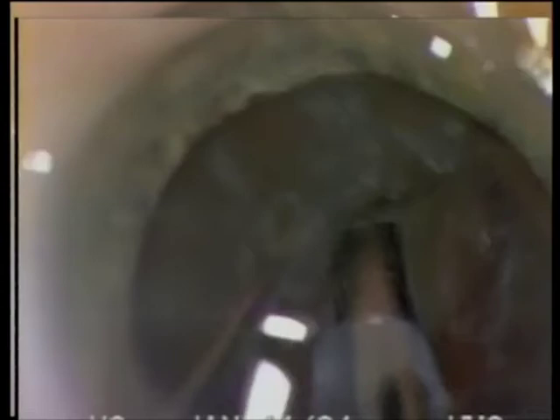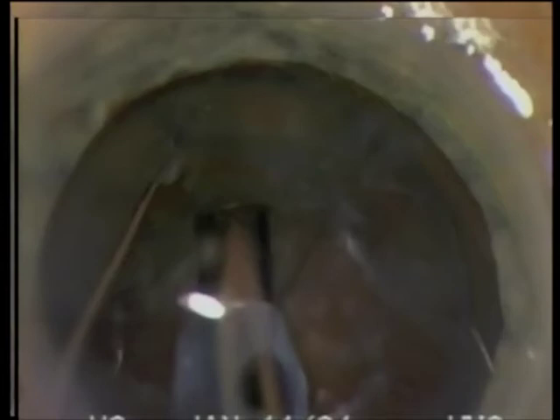Additionally, you will notice that at these high aspiration flow rates and vacuum levels that I use in Memory 3, once occlusion breaks, the eye remains extremely stable. I have found that the advanced fluidic capabilities of the Legacy allow for a stable chamber over a wide range of parameters. These advanced capabilities allow me to safely and effectively perform my crater chop technique.